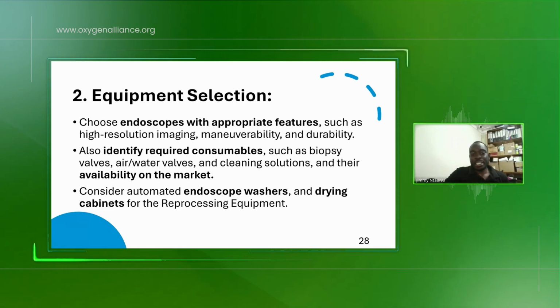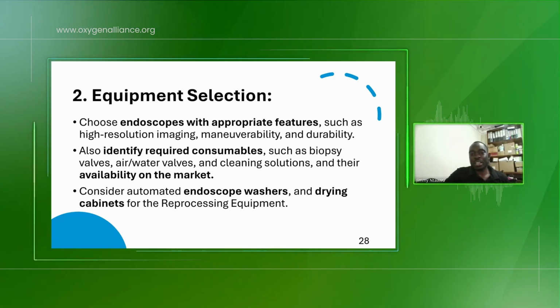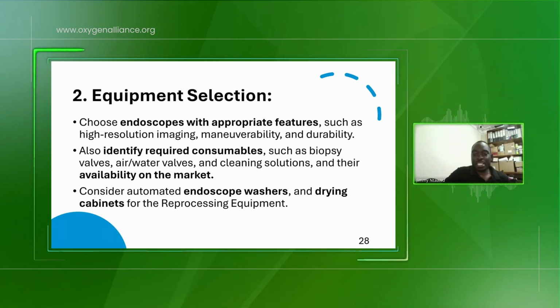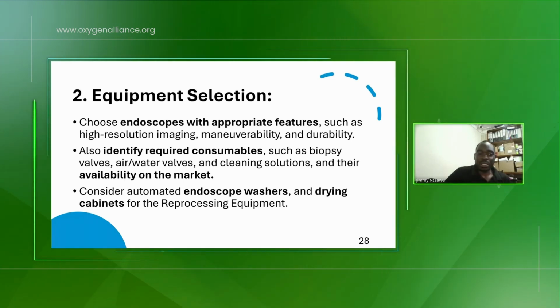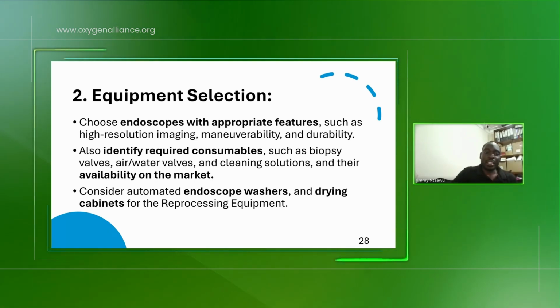Then the drying cabinet. This is very key. Usually we equip them with ultraviolet, so that we can kill the germs. So drying cabinets, if you can manage, you also equip yourself with one.